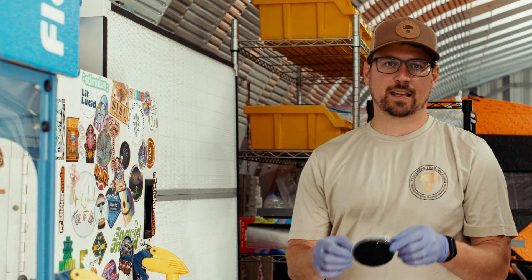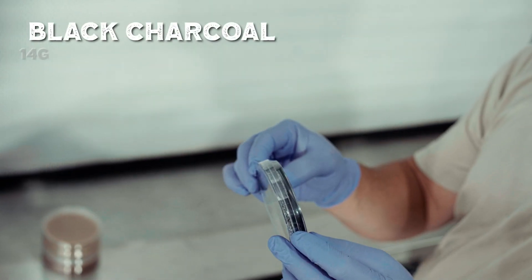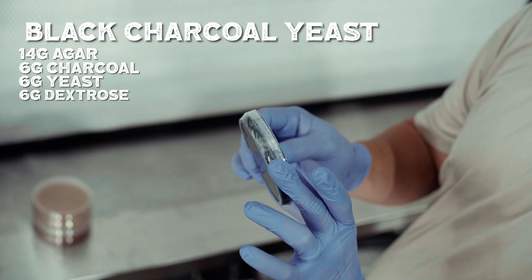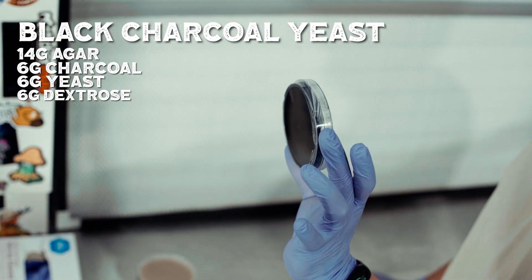Last is our BCYA, or black charcoal yeast agar. It's 14 grams of agar, 6 grams of charcoal, 6 grams of yeast, and 6 grams of dextrose. It's a really nice black color.